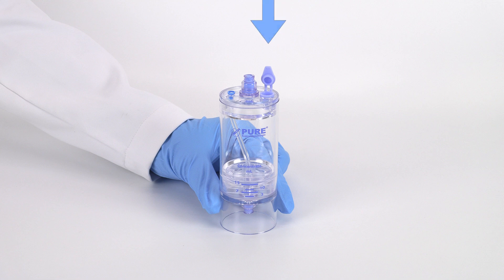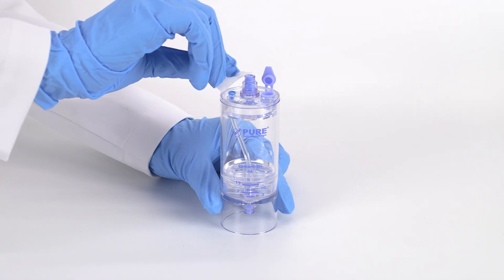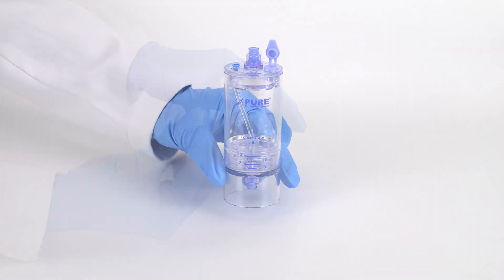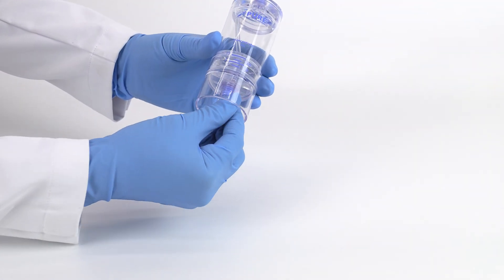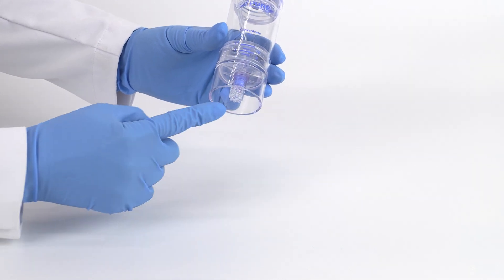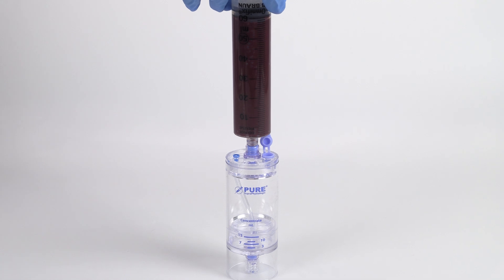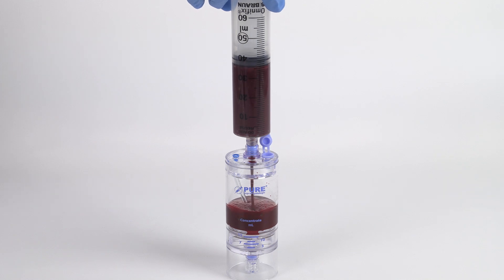Make sure the vent lid is in the open position. Swab the ports with sterile alcohol before and after accessing with a sterile syringe or cap. As a mandatory step, always attach the clear non-vented cap to the bottom port prior to centrifugation. Attach the 60 milliliter bone marrow syringe to the top port of the device and slowly inject bone marrow into the device.